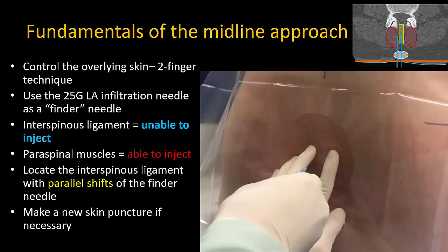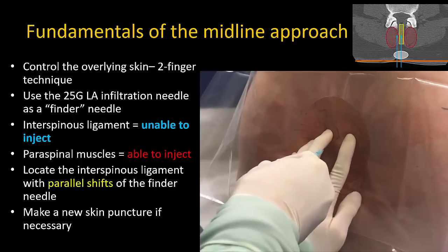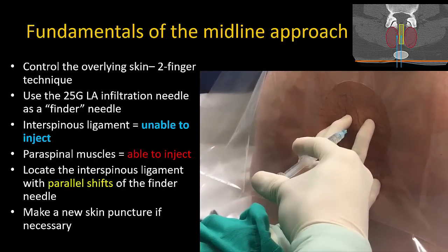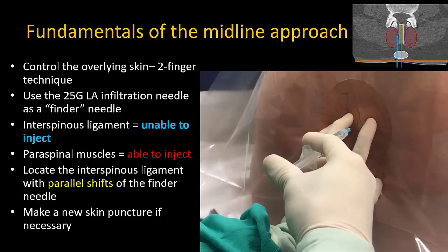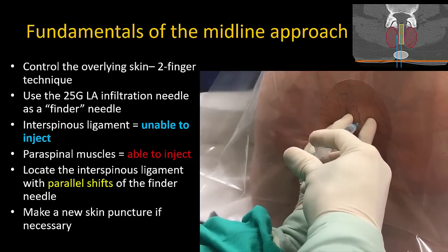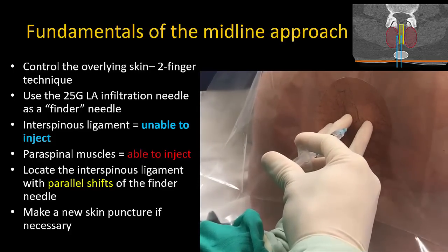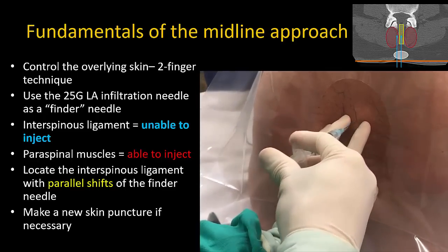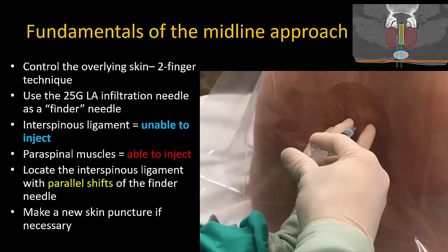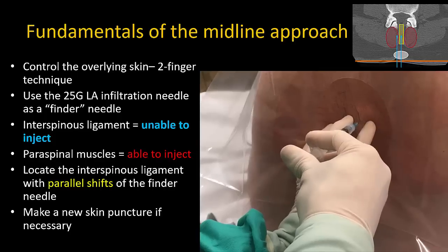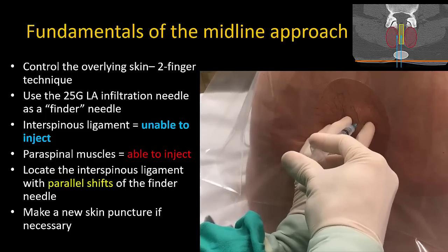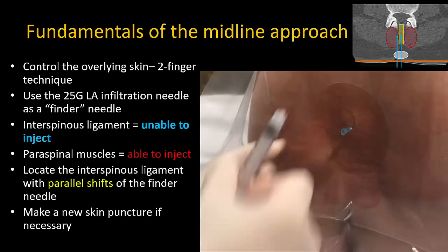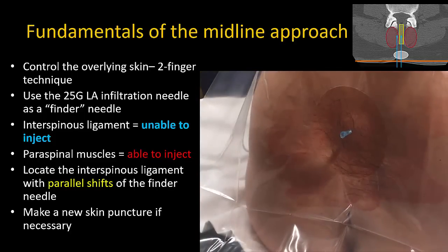This video illustrates all of the above steps. Fix the skin between two fingers placed on either side of the interspinous ligament and insert the infiltration needle. Inject local anesthetic to anesthetize the skin and subcutaneous tissues, then advance the needle deeper and perform test injections to locate the interspinous ligament and midline. Here I am able to inject, signifying that I am in muscle and not the midline. I withdraw the needle to skin, drag the skin to make a slight parallel shift, and reinsert and re-inject — repeating left and right until I find absolute resistance to injection. The needle is now anchored in the interspinous ligament and I leave it in place as a guide for subsequent insertion of the introducer or spinal needle.